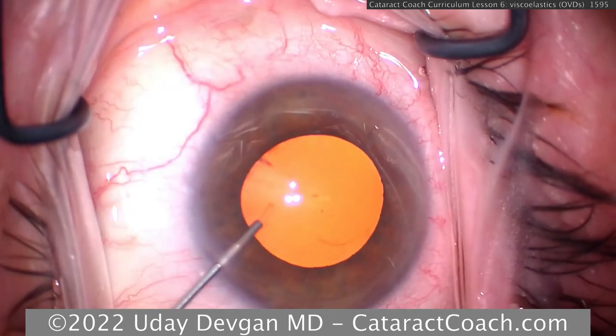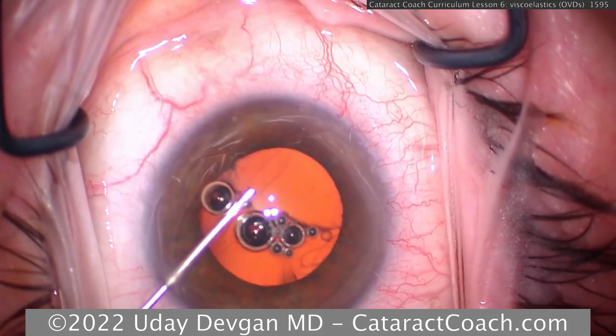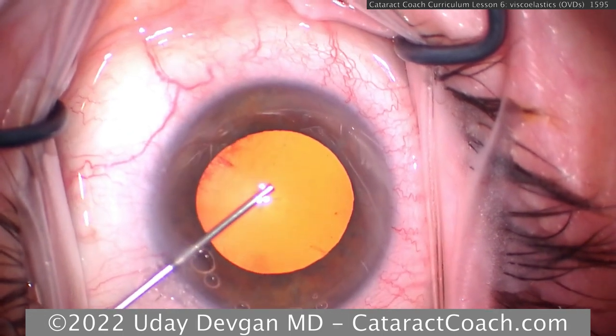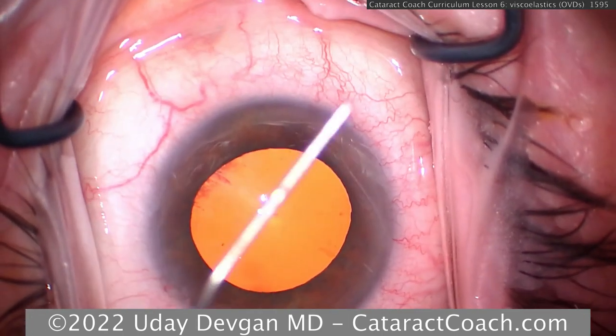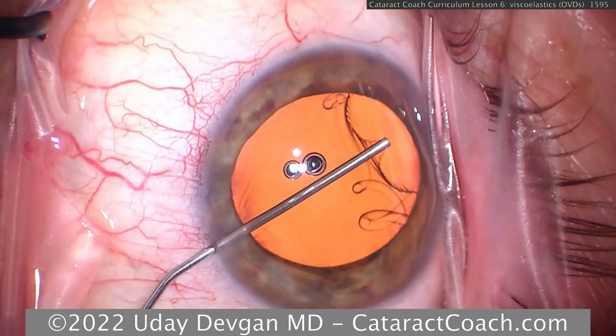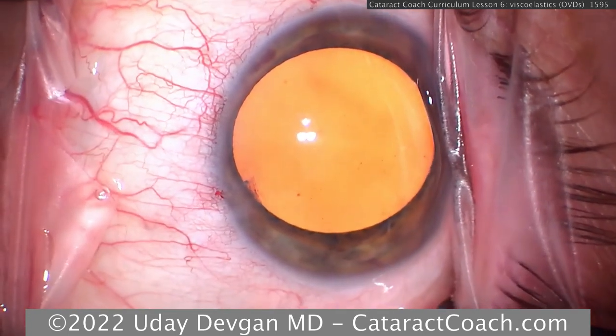So our dispersive cannula goes across the eye, we inject, and there's the wave. And you can see how it pushes the bubbles out to the periphery, to the angle of the eye. And that's a nice, good, solid fill, good pressure. So again, come across the eye, there's spaghetti string, that doesn't work, so we have to do a wave, a little bit more force on the plunger.